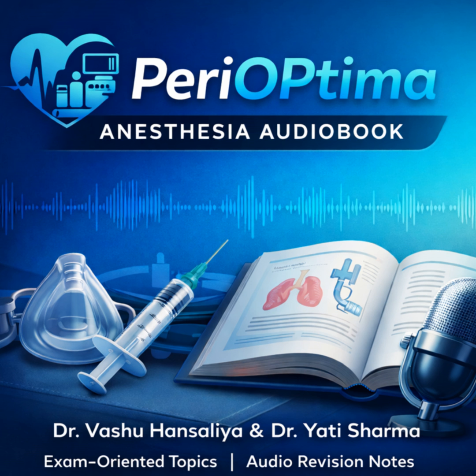And interpreting the blood pressure. This confuses students because there are suddenly so many peaks on the screen. Yes, you will effectively see 3 pressure peaks on your arterial line. Number 1 is the unassisted systolic pressure, which is the patient's own weak beat if they're on a 1:2 ratio. Number 2 is the diastolic augmentation from the balloon inflation.